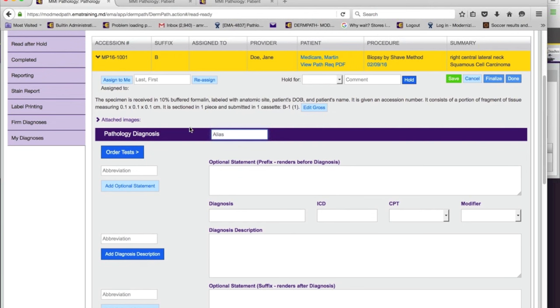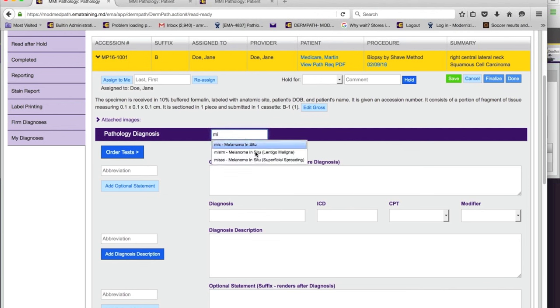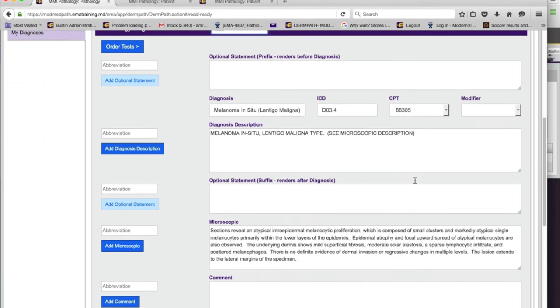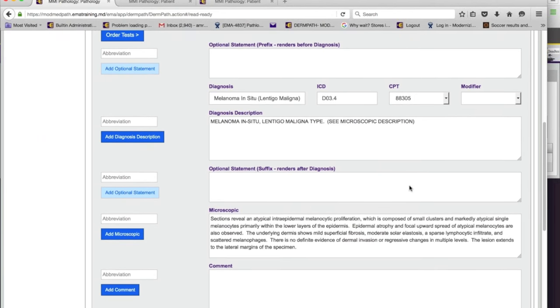I'll go to case B, the next case. This screen is driven by aliases. If you do the setup and edit the library we gave you or add your own diagnoses, you can start typing your alias and find it — it fills the screen for you. All of this comes from setup: the diagnosis, the diagnosis description, the microscopic, and any comments. We calculate the ICD data on the fly based on the body location and the structured diagnosis.